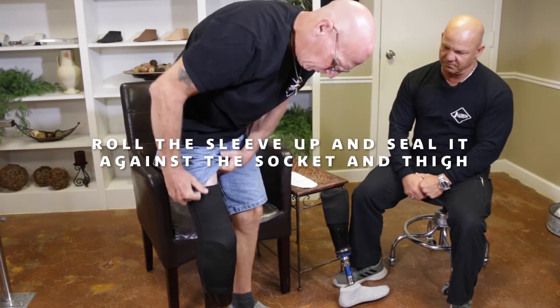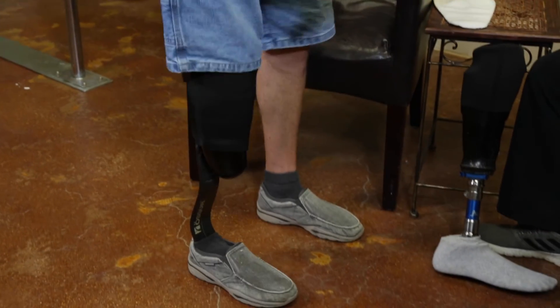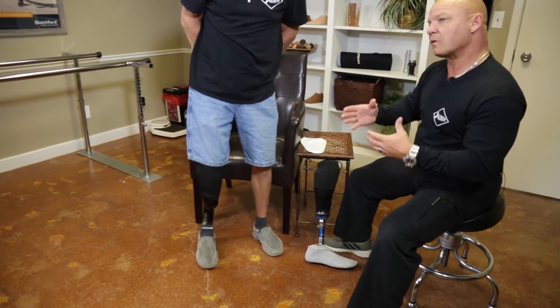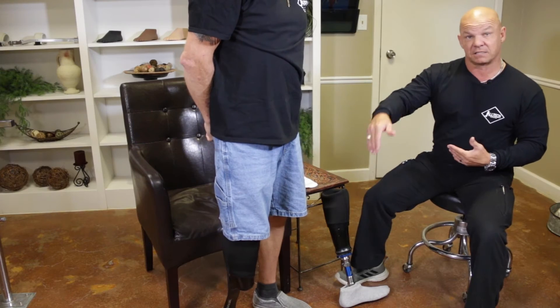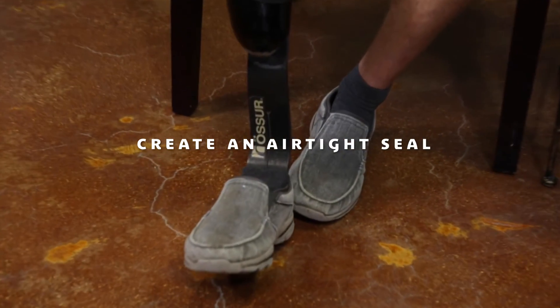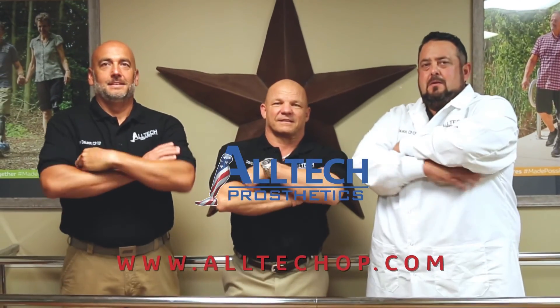Rolling that sleeve up seals against the socket and against his thigh, and it's airtight. All of the air has been displaced out of that socket by his leg, so there's no air left, and we've sealed air out of getting into that socket. So if air cannot enter that socket, it can't fall off — and that's why we call it suction. It's a very dependable way to suspend your prosthesis.